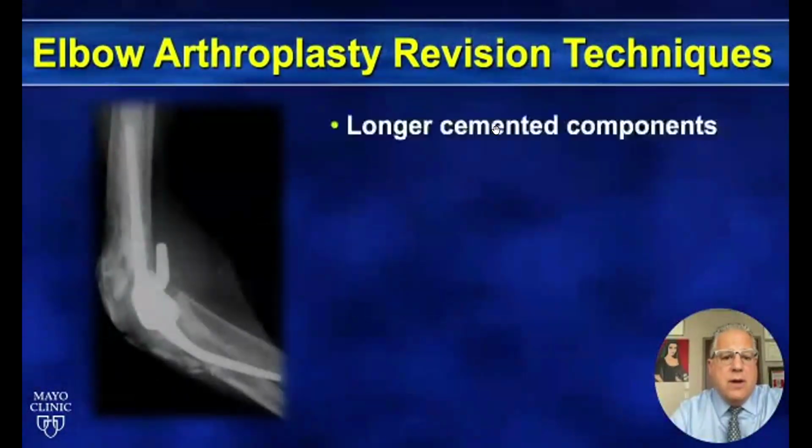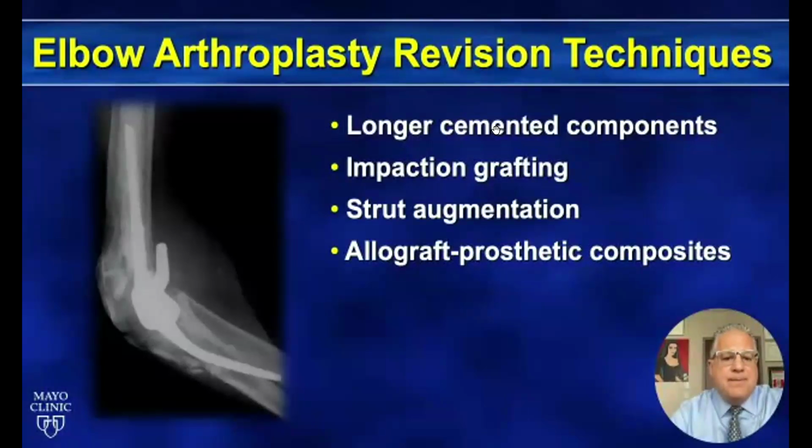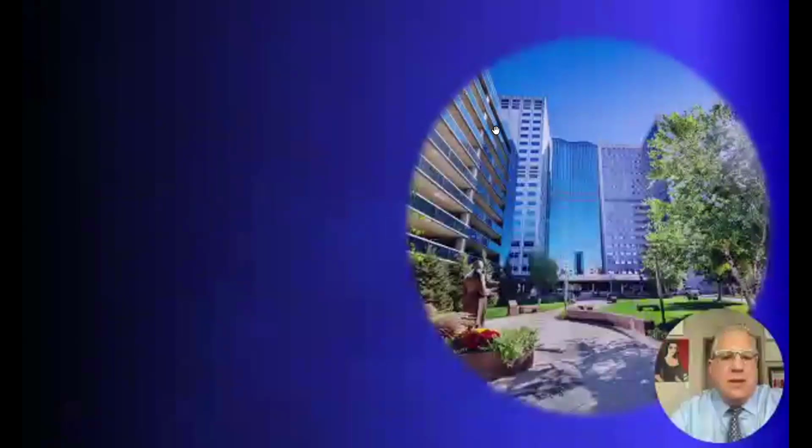These may include longer cemented components, impaction grafting, strut augmentation, APCs, modular metallic replacement, and very rarely permanent resection or amputation. Thank you very much for your attention and have a wonderful rest of the evening.